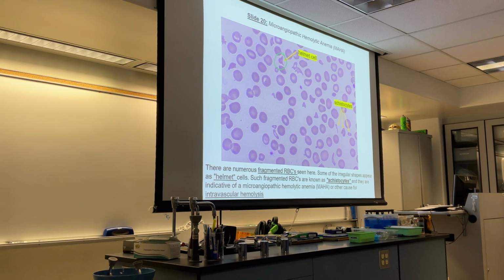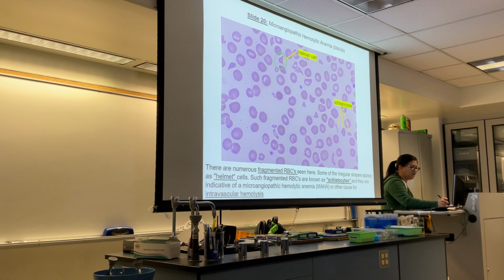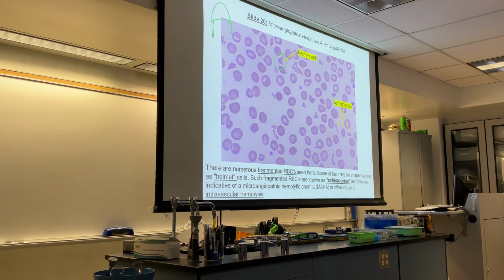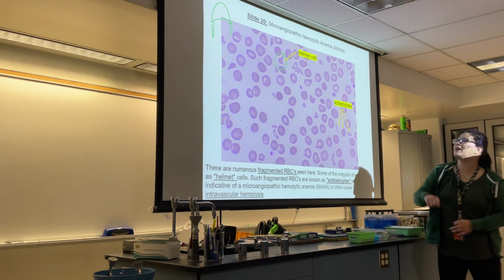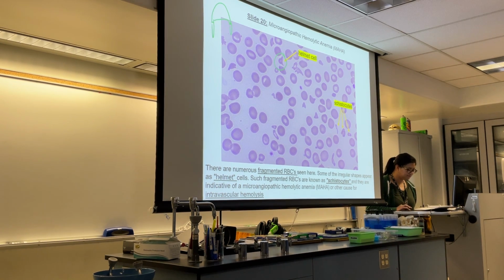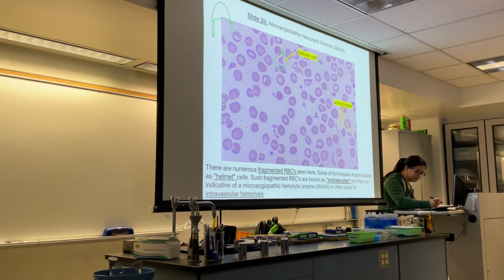These are actually based on military helmets. They're called helmet cells because your helmets are typically shaped like this, and then you have the straps hanging down for the bands that go around your chin. So look at the helmet cell schistocytes here. Notice how they have things that are kind of popping off on the sides. Right here. And here's another helmet cell right here. This one would technically also be considered a helmet cell even though it has 3 little bumps instead of 2.